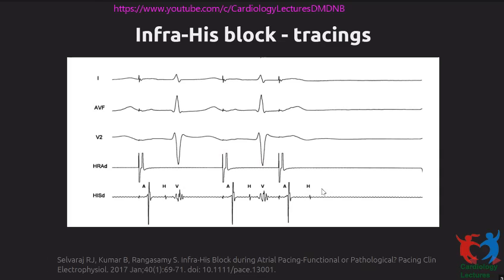So it is very important to understand that a property of the His-Purkinje system is being very exquisitely sensitive to the preceding RR interval. So the HH interval here is long. So after this long HH interval, the refractory period of the His, because of this long interval, will again be long. So when the next H comes in much earlier compared to this previous HH, it tends to block as a physiologic phenomenon itself. This is not an indication to pace.